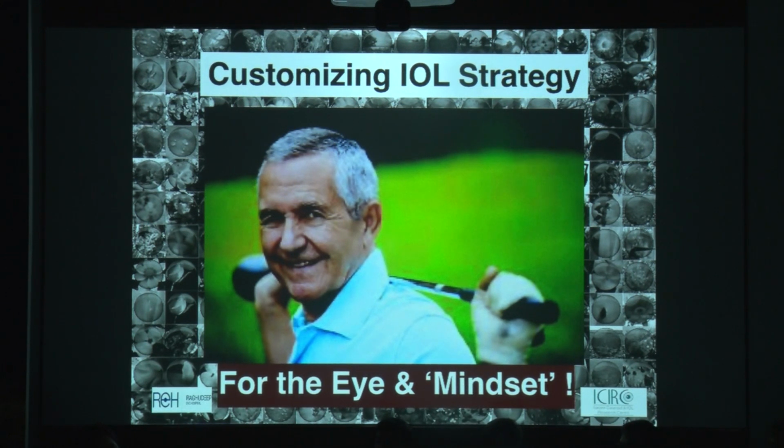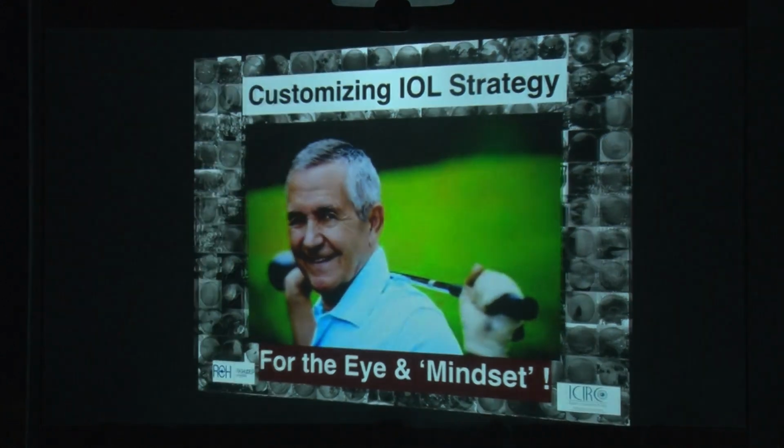So I think again the point here is that with the newer IOLs, these dysphotopic phenomena are, I would not say not there, but very, very less, and therefore you can do toric IOL or trifocal or any form of multifocal toric IOL correction, even in people who have so-called red flags. About 10 years back, we used to say with the +3 and +2 type of IOLs, that please don't do that because they would have a lot of glare.